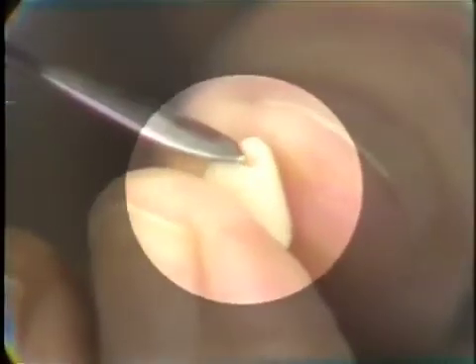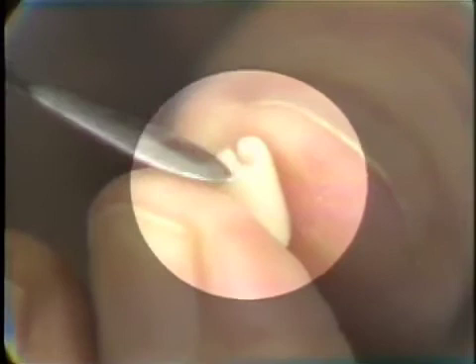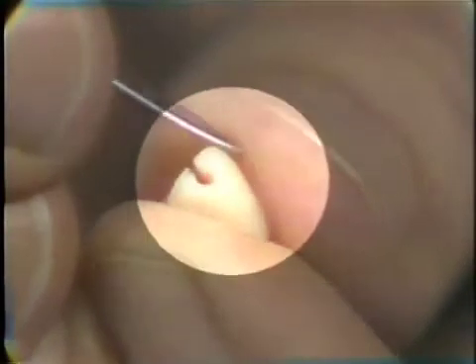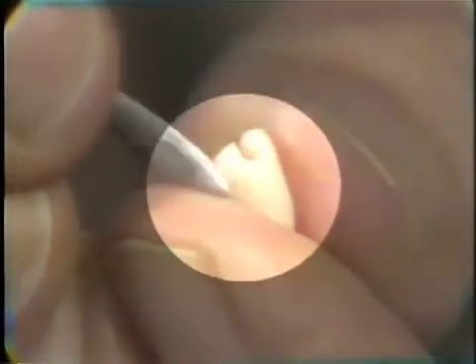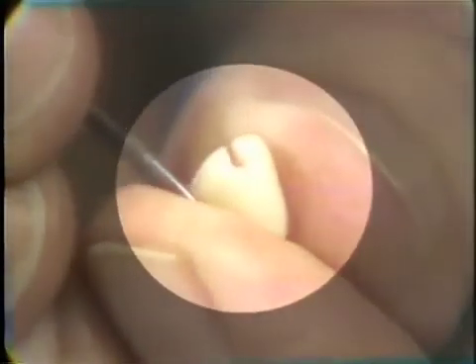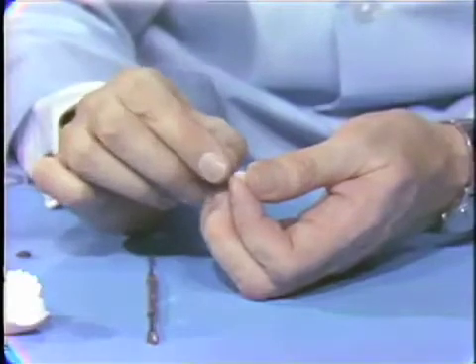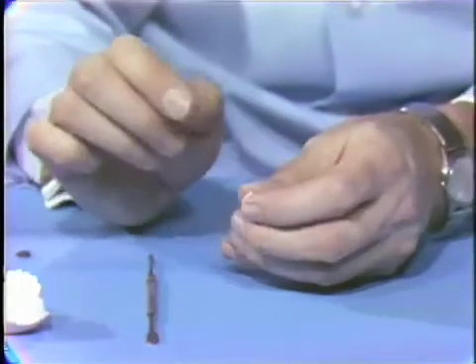And if you like to just bevel across the keyway here, you can have the gold occlusal extend down and protect that. And that can be combined in this case with the proximal bevel, so that you get a shoulder of gold coming down on the proximals and the lingual surface there. So I'm just going to grind that surface now to bevel it and make that adaptation before we adapt the metal backing to it.